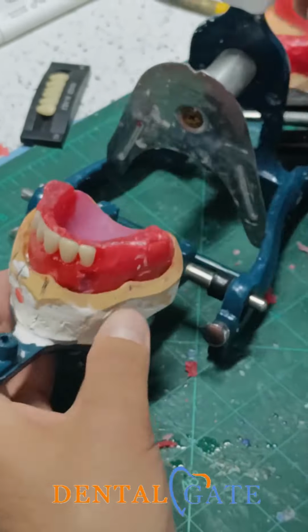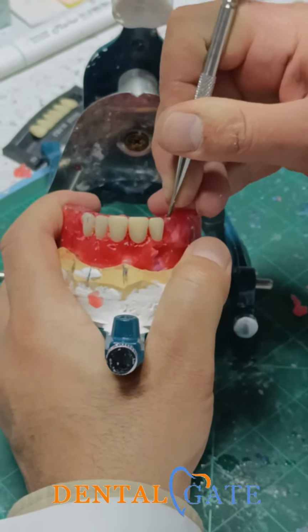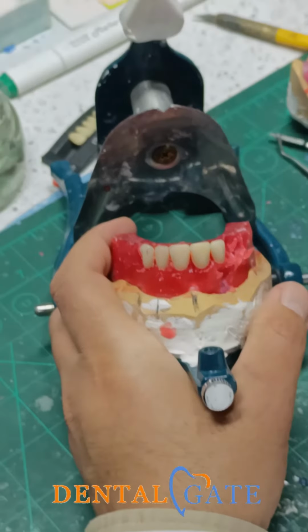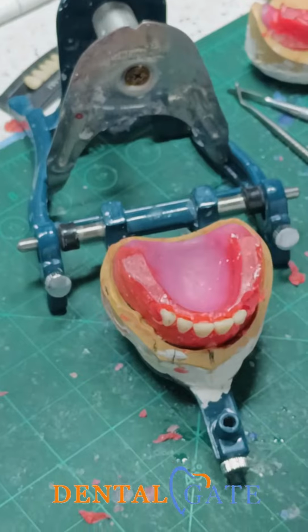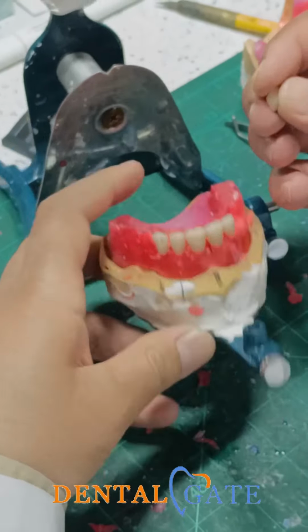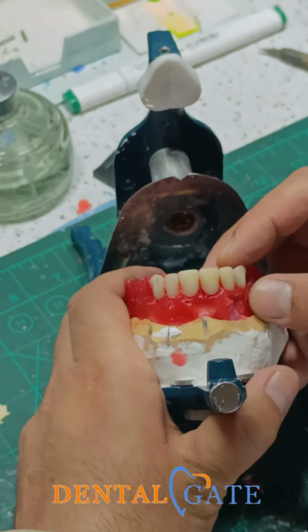So it seems good. Now, I will start with the canine according to the criteria of the canine. I will repeat the procedure on the other side. I just need to preserve the curve and maintain the midline. So regarding the canine, just put it parallel to the vertical axis, and make sure the contact area is in the correct position.